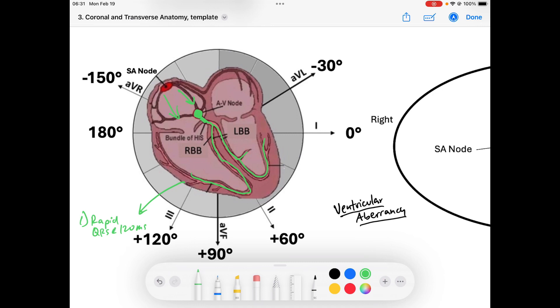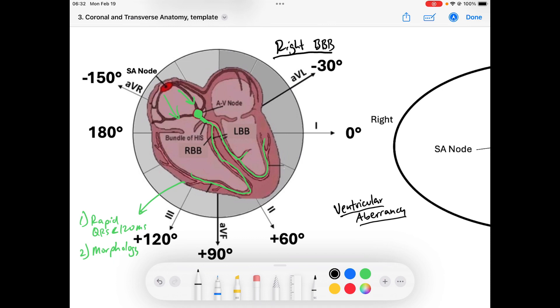That's why our QRS is less than 120 milliseconds in duration, or three small boxes. It also allows for a certain morphology of the QRS. In a right bundle branch block, the right bundle is blocked — I represent this with a red X on the right bundle. That means the right bundle from there down is not working.